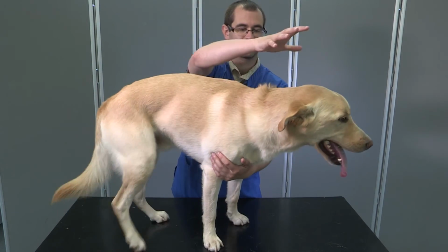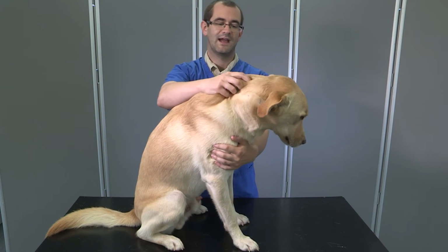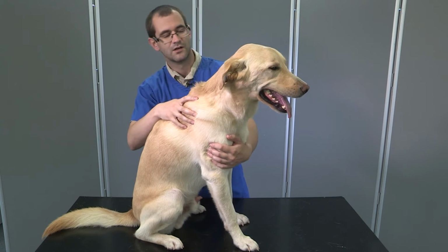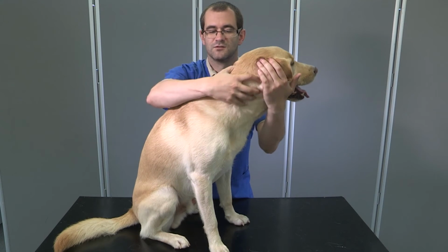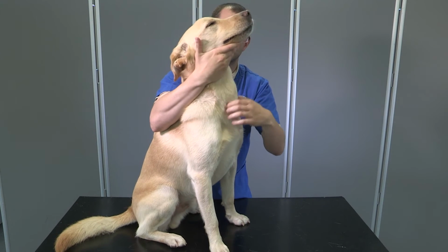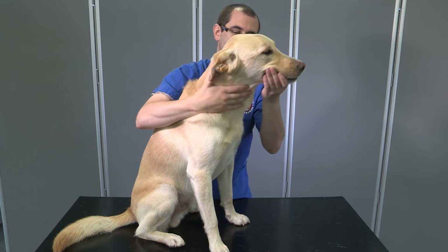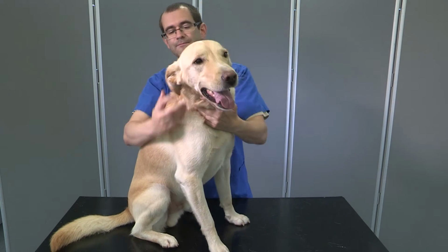As before, we're going to work from cranial to caudal. At the cranial end, we have the neck musculature at the front here. So we've got a nice band of muscle all the way along the neck, at the dorsal part of the neck. Everything that we want to miss, so jugular vein, carotid artery, windpipe, and esophagus, are all at the bottom here. It's got a nice big bit of muscle belly here.